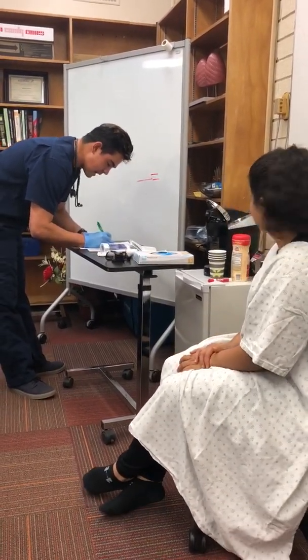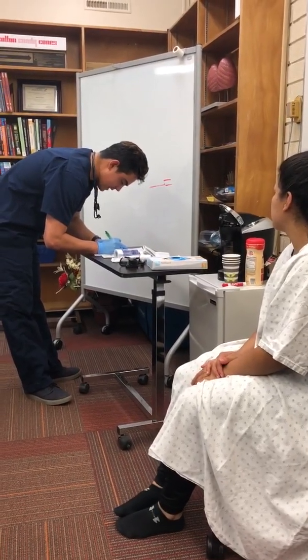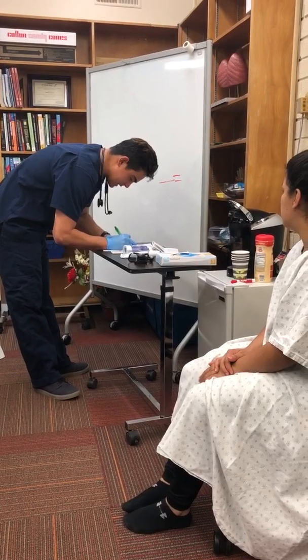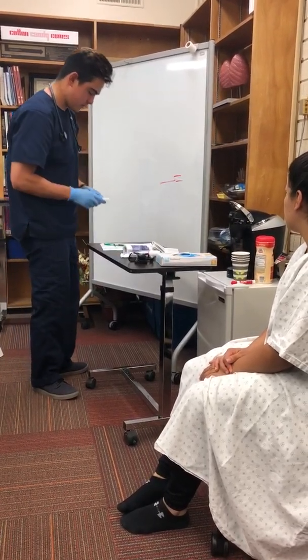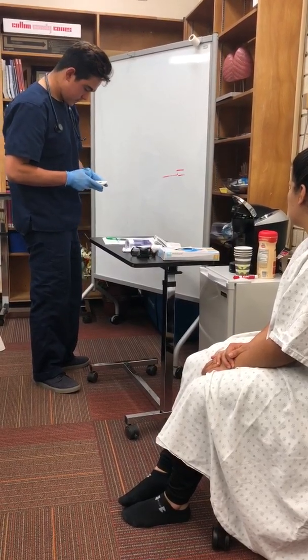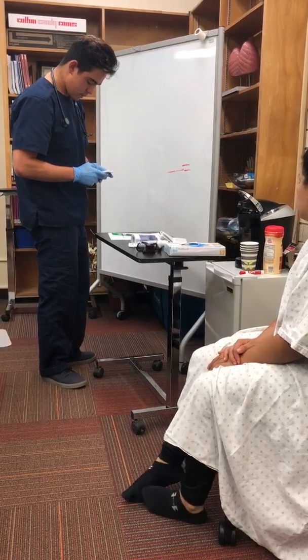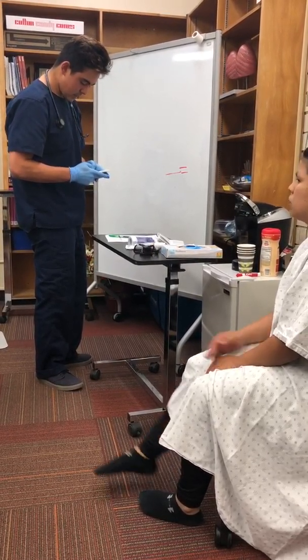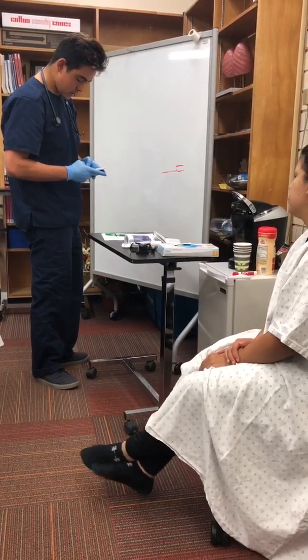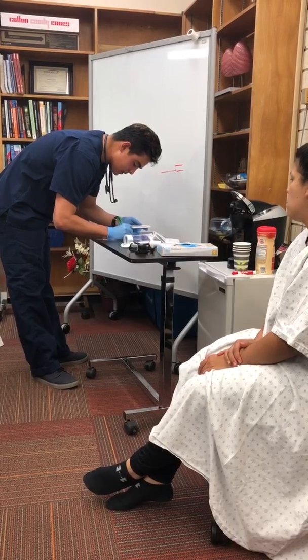So we're going to take the 430, that was the best measurement we got, divide that by the 418, and then multiply by 100. Do the calculation real fast. 430 divided by 418. Alrighty, so we're at 102% compared to your predicted.